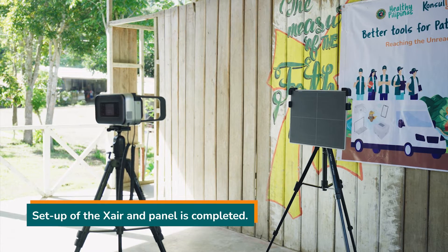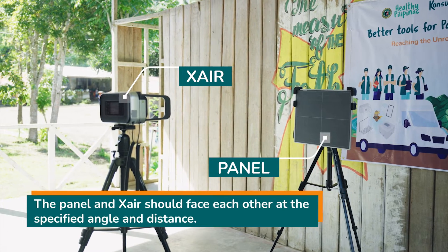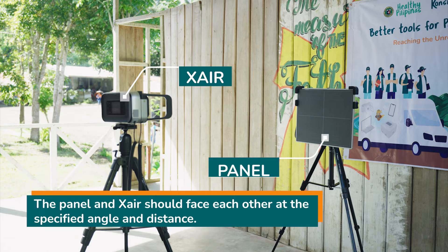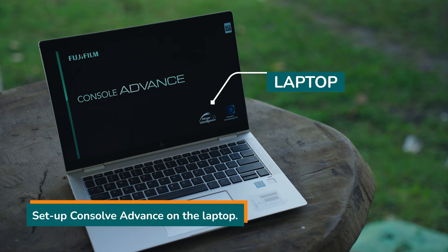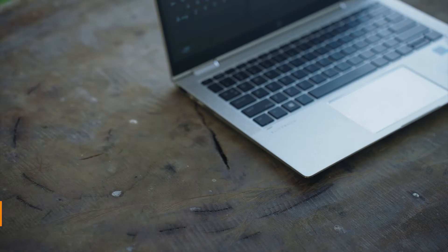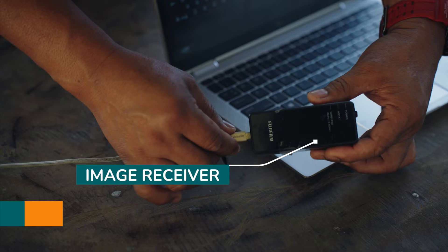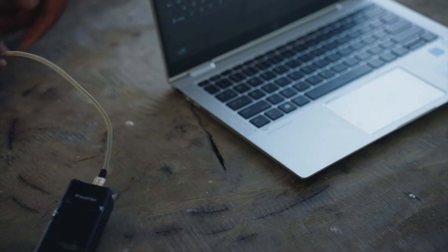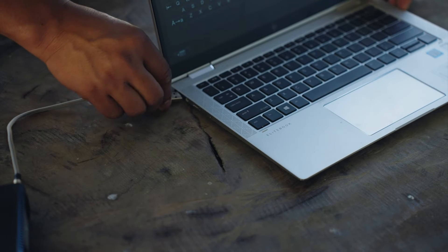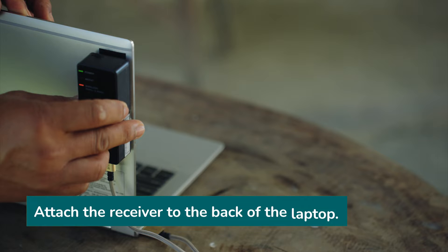Setup of the X-ray and panel is completed. The panel and X-ray should face each other at the specified angle and distance. Setup can also be done on the laptop. Connect the image receiver to the laptop and attach the receiver to the back of the laptop.